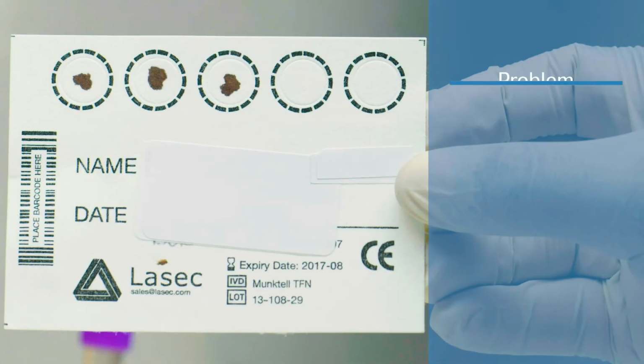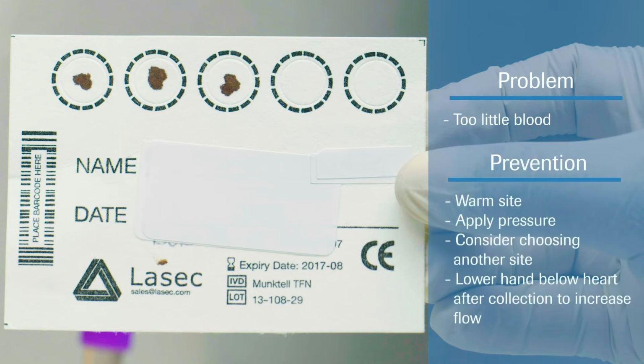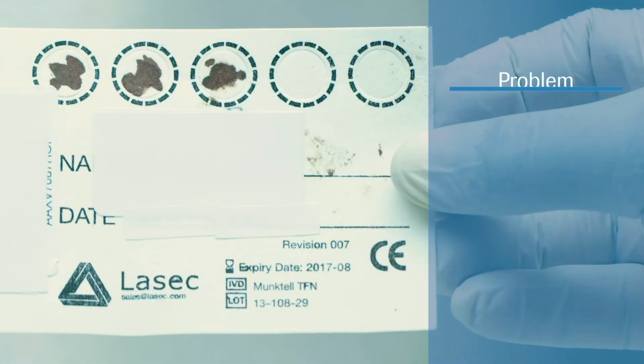Using too little blood also results in an untestable sample. If one of your drops is too small, you can put another drop directly on top of the wet drop until the spot is completely filled before moving on to the next circle. If you cannot get large enough blood spots, the puncture site may be cold. You may not be applying enough pressure, or you may need to choose another site and prick the patient again.